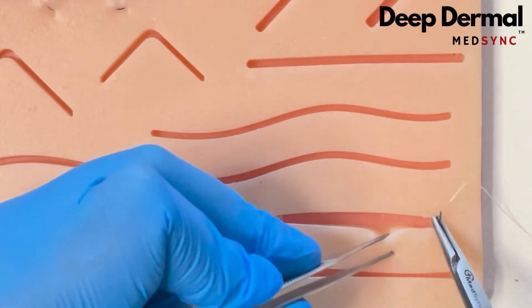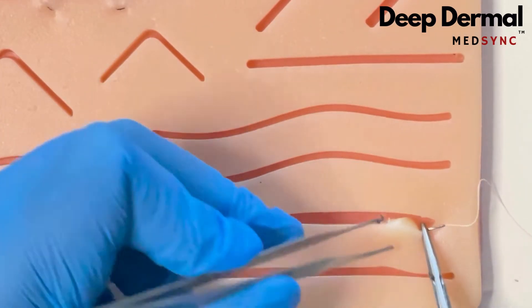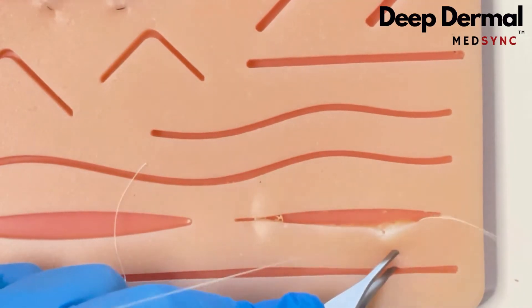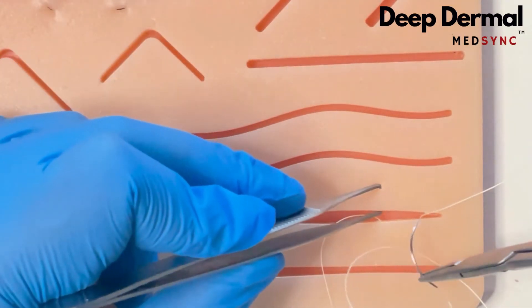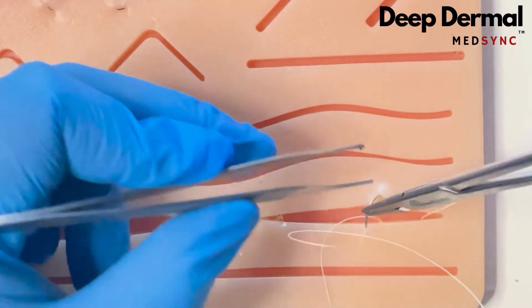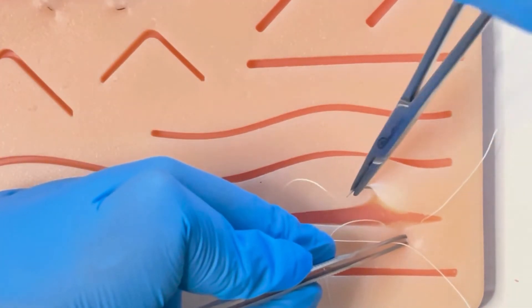The deep dermal: this technique buries the knot once it is tied. You start deep and exit superficial on one side; on the other side you enter superficial and exit deep.